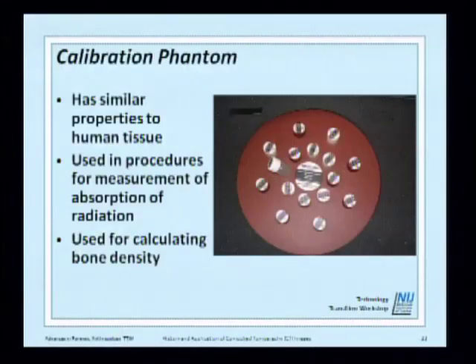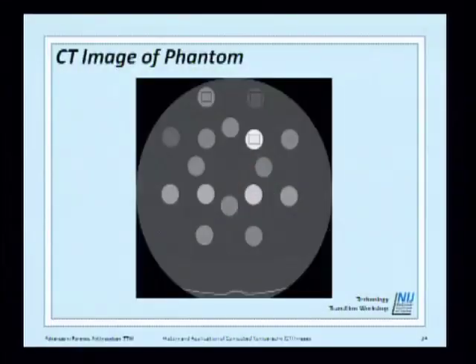It's a kind of platform, and these tubes have material similar to soft tissues. So you can run it with the scan, actually. Here is how it goes. You put your scan specimen, say a cadaver. Even with live patients, I use it too. So you put your cadaver, you put your bone, whatever, and the technologist will play with all the parameters I mentioned, intensity, window, all these parameters. And once he's done and the scan goes on, it will be applied also to the Phantom. So now you have your sample and the Phantom together.